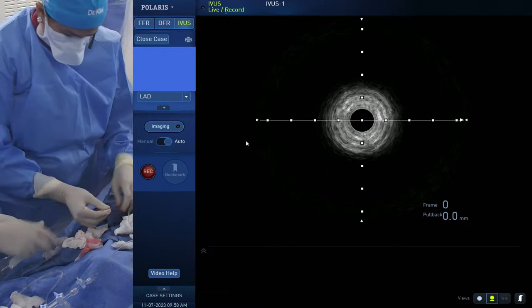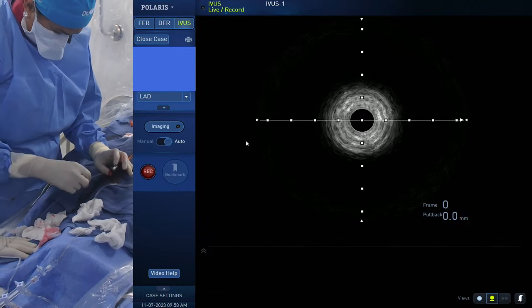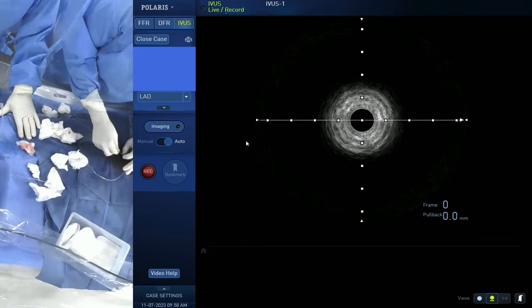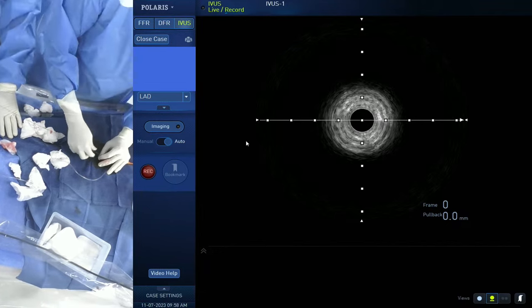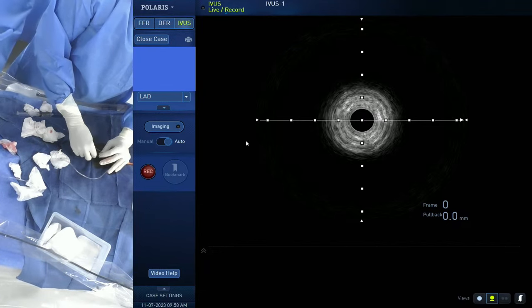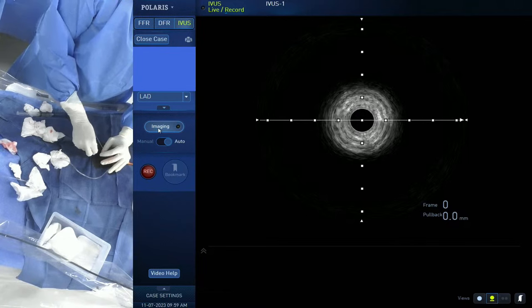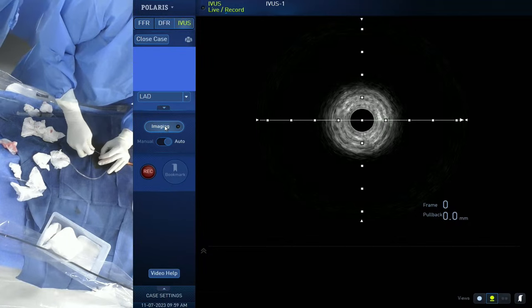So we are doing the IVUS first, before even showing the angiogram. Look at that, what confidence. And one thing we have repeatedly shown is that there is minimal or no wire coming back. Perforation could sometimes happen, but usually it's adventitial staining. True frank perforation is not reported in any studies. Actually, one or two have been, but those were after the stent placement, probably where the stent was expanded at too high a pressure.